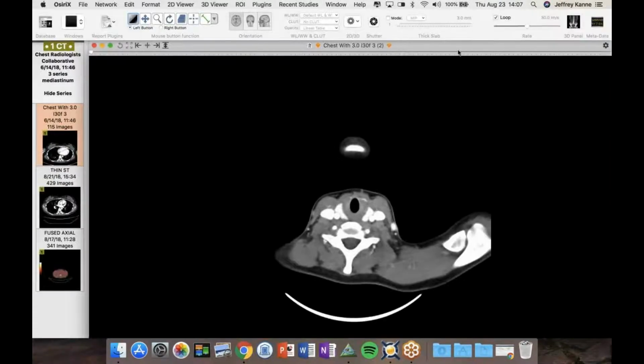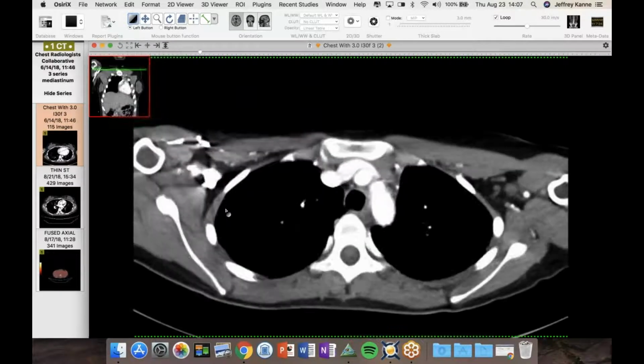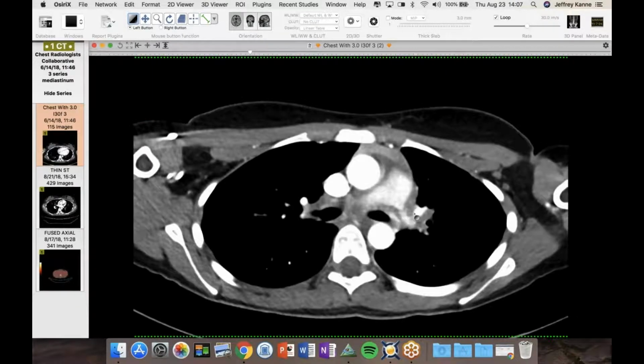Okay, let me show this one now. This is another case, and I showed it to some of you earlier this week. This is a 19-year-old woman with a history of ulcerative colitis that has been treated with medicine and has been doing fine with that. But she's developed progressive shortness of breath, and I only loaded a few scans up for this webinar, but she has a very interesting finding in her mediastinum. She's got this severe stenosis of her left main pulmonary artery and this soft tissue around it.